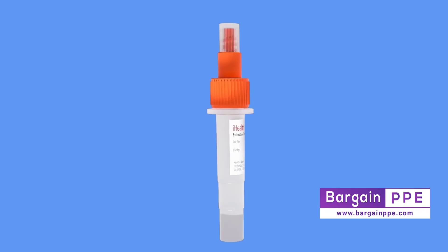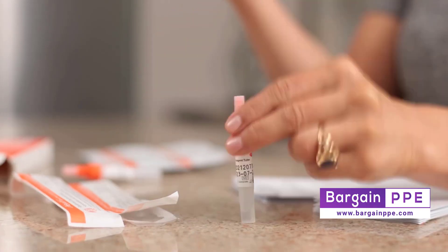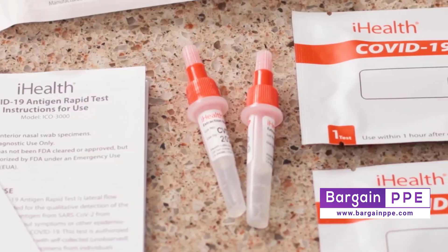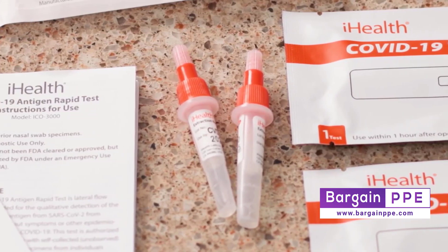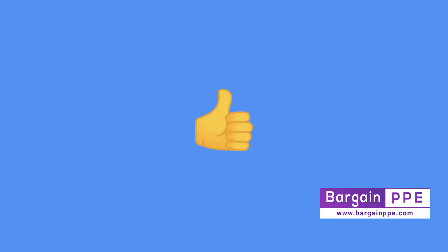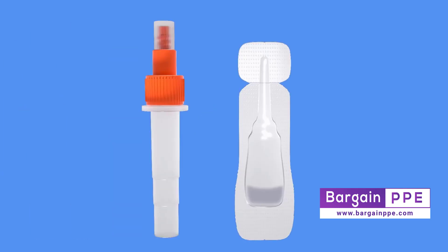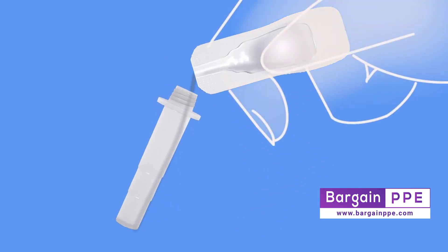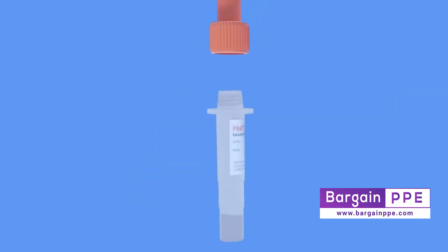If your tube already has liquid inside, you can skip this next part, but go ahead and tap your test tube three or four times against the table to shake up the solution and get it ready for the test. Your test tube will likely have the testing solution already inside, but in some cases you may have received the solution in a separate packet. If so, no problem — pour it into the test tube before we start. Remove the larger lid, carefully tear off the top portion of your solution packet, and pour the entire contents into the tube. Careful not to spill. Now put the lid back on the tube and you're ready to go.